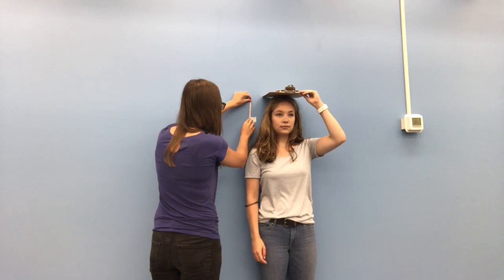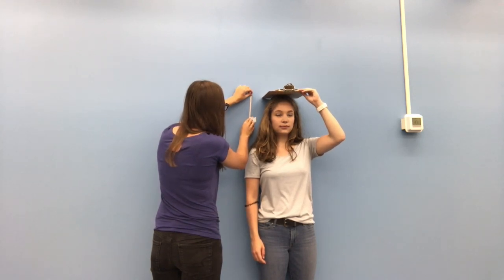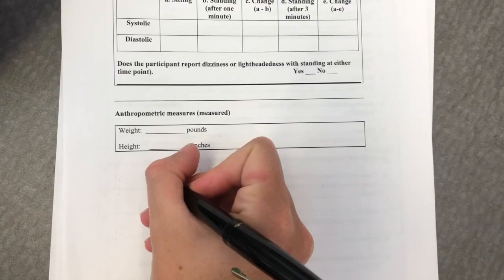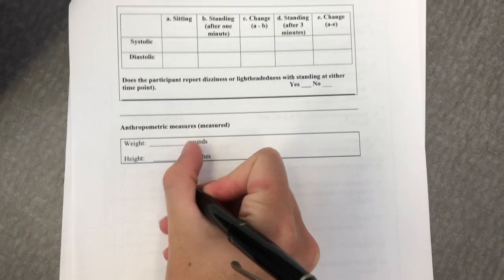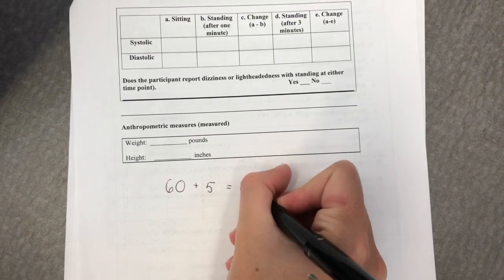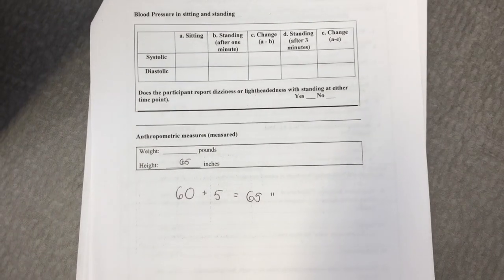Using a book or an object with a straight edge, rest it on top of the participant's head so they can get a true measure of their height on the wall. Using a tape measure, measure up or down from the 60 inches mark, then add or subtract that number from 60 inches to get the participant's height. Record the number in inches on the data collection sheet.